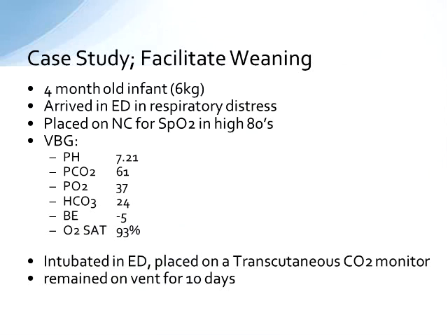And the blood gas obtained in the ED, the VBG, is in front of you there with a pH of 7.21 and the CO2 of 61. So that kiddo was intubated in the emergency department at that time, rather than pushed on non-invasive ventilation because of the pH and because of the significance in work of breathing, and placed on a transcutaneous monitor and titrated throughout the stay using the monitor and blood gases. Every time they tried to wean this child down to less respiratory support invasively, the child would have significant increases in respiratory rate and increased need for oxygen.